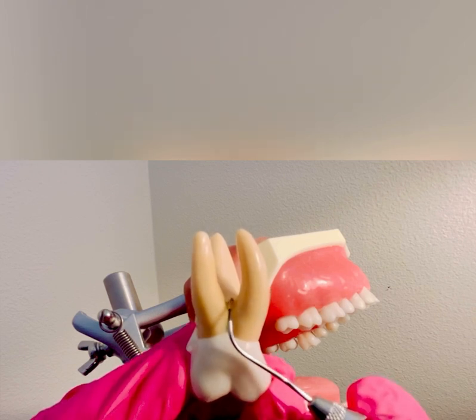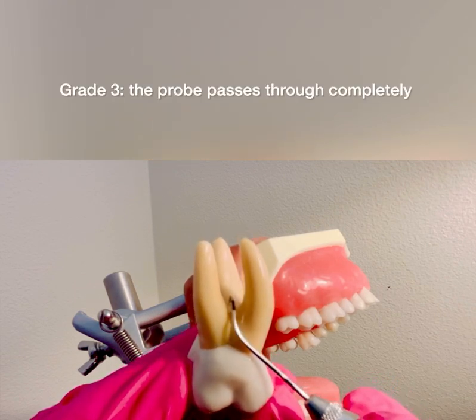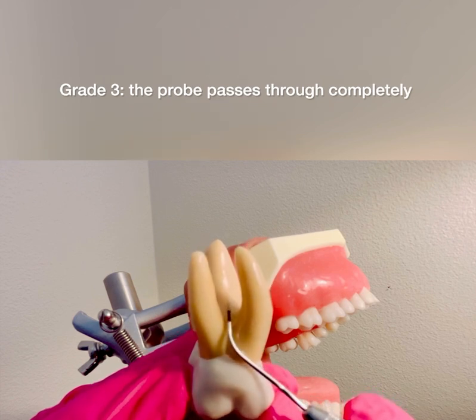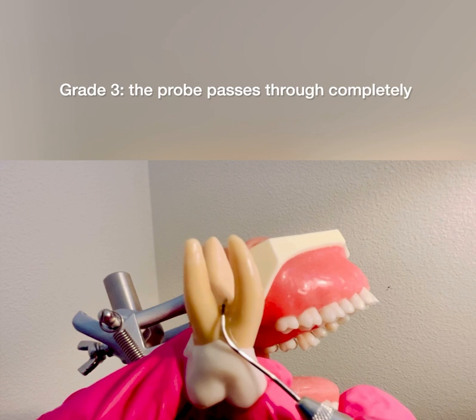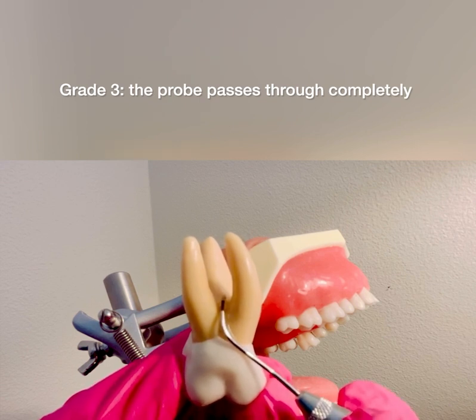If I can enter the furcation completely through and through, and I'm assessing I can feel the palatal root, and I cannot clinically see the furcation involvement, that would be a grade three.